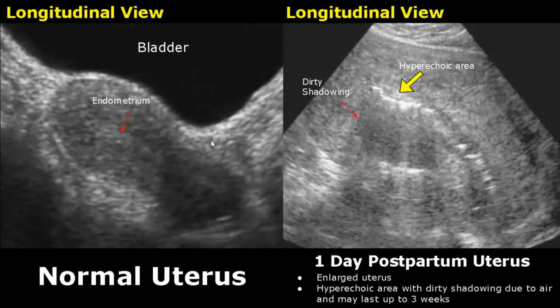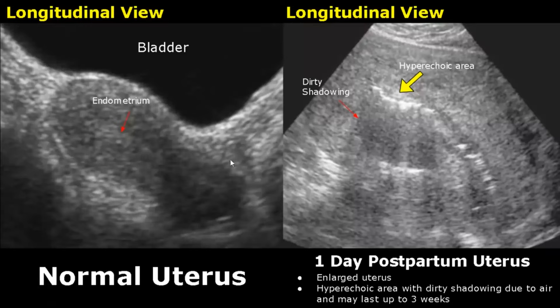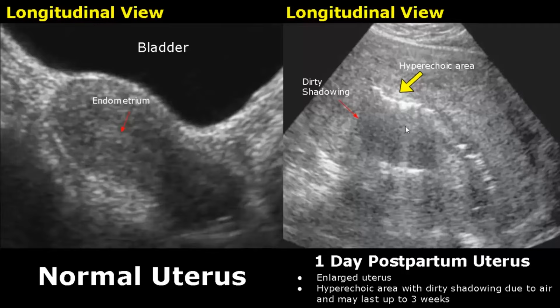Postpartum findings are features seen in the uterus after delivery. On the left side is a normal uterus without any recent pregnancy, showing normal size, echo texture, and shape. On the right side is a one-day postpartum uterus — the uterus is enlarged, and by comparing it with the normal uterus we can see it is much bigger. The endometrial canal can have hyperechoic bright areas.